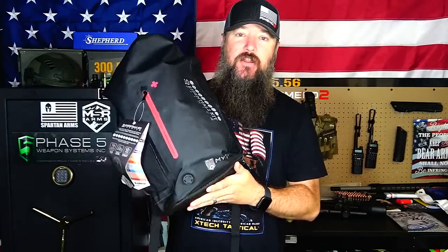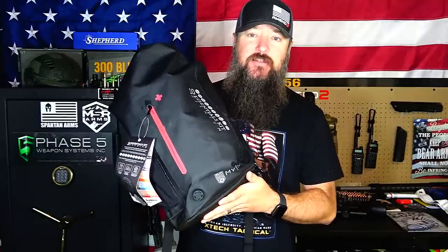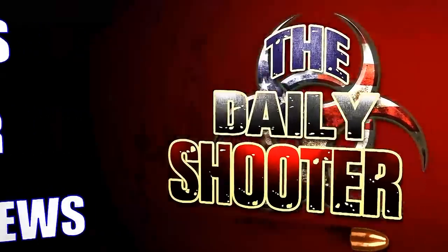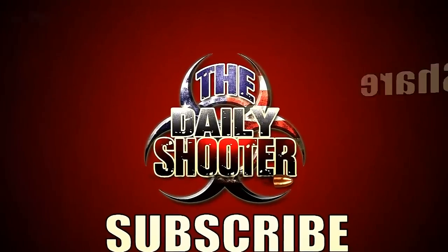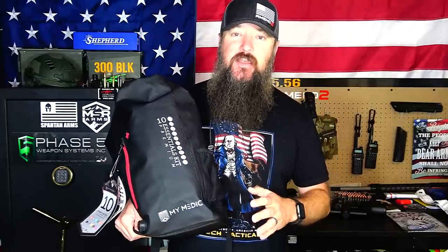We're going to go ahead, take everything out, and take a look at what you get in the MyMedic 10 Essentials Kit. If you guys are interested, there'll be a link down below. Before we dig into this thing and show you all the different stuff — there's over a hundred pieces — let me talk about the pack real quick.